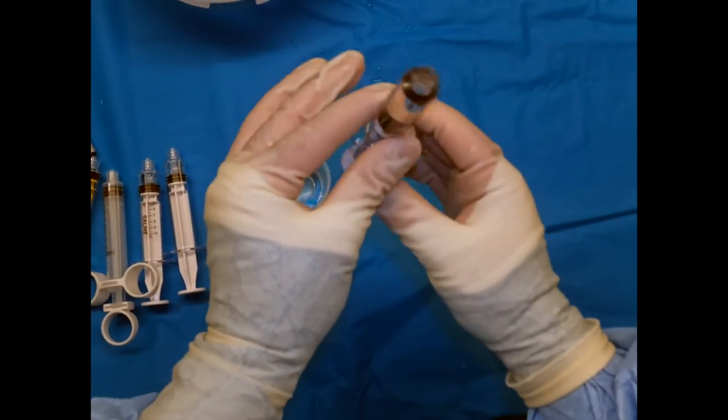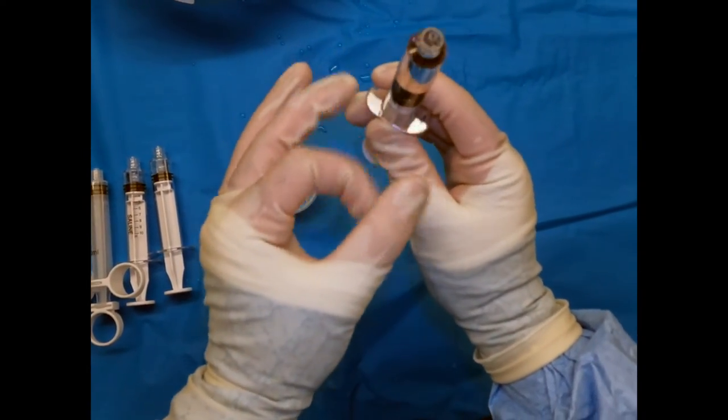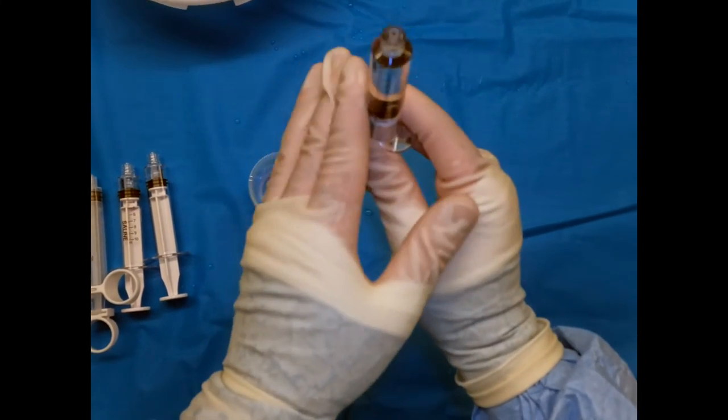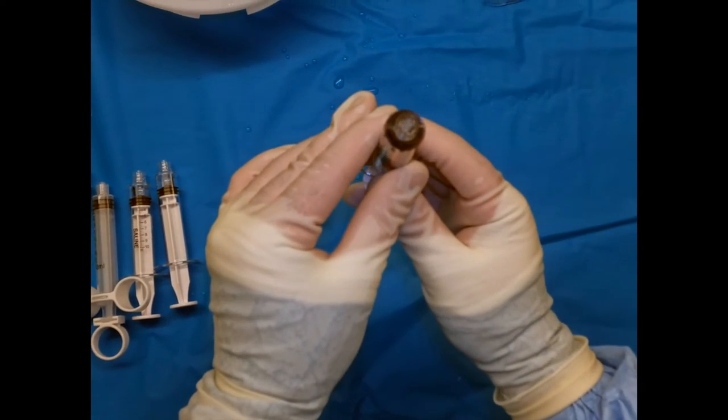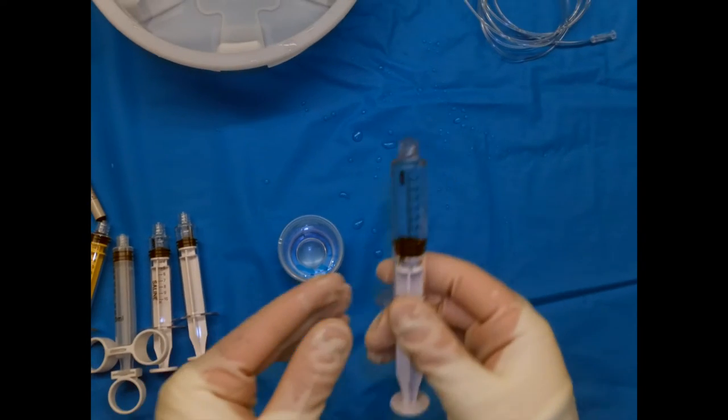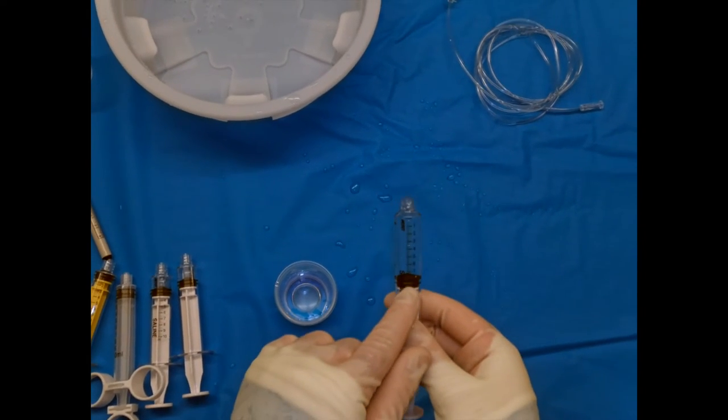Up around the plunger right there. So we're going to now face it all the way up and tap to get the bubble to the top, and we'll push the air out.